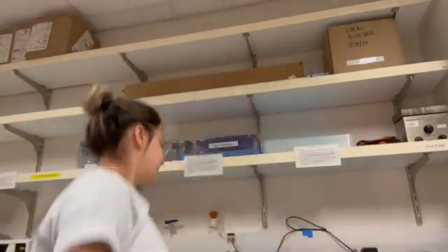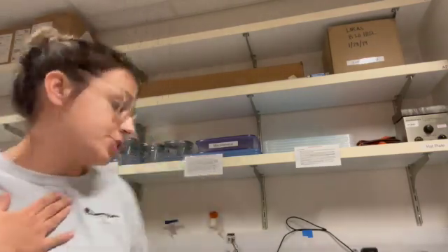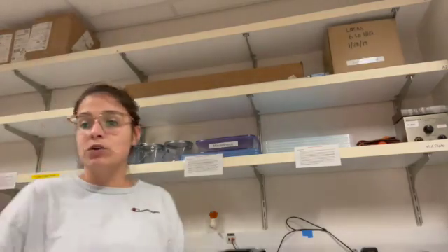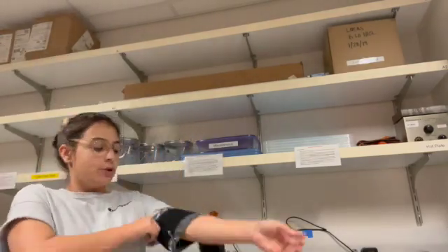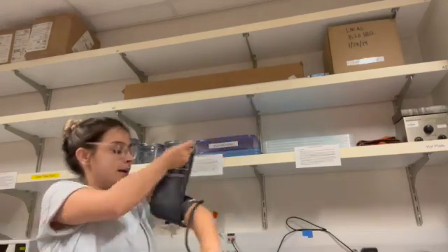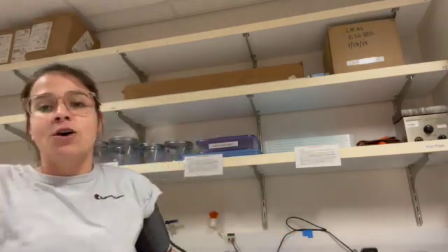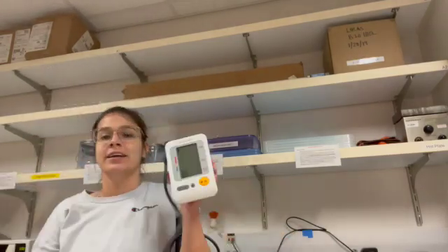Okay, I think that's good enough. So now they're going to measure their heart rate and blood pressure immediately afterwards, and for 4 intervals afterwards. All right, one more time. Here we go, and we gotta count.